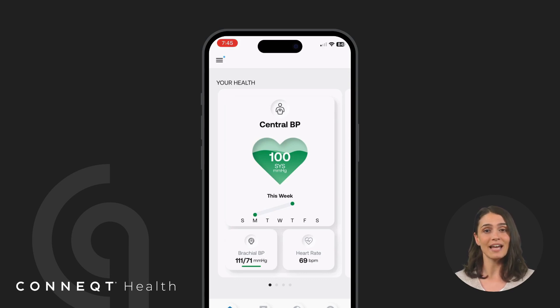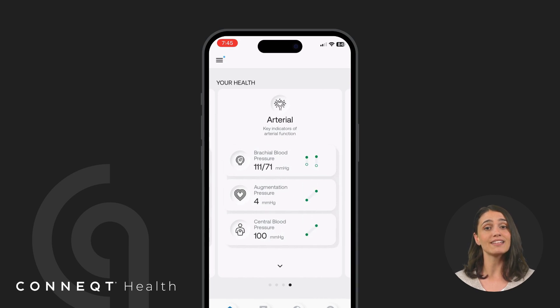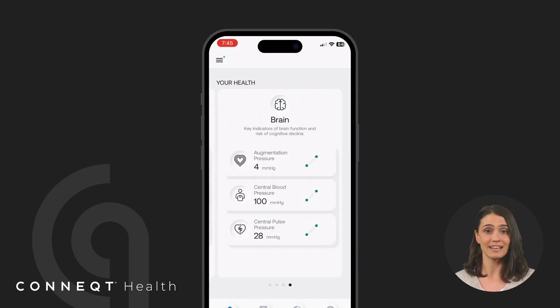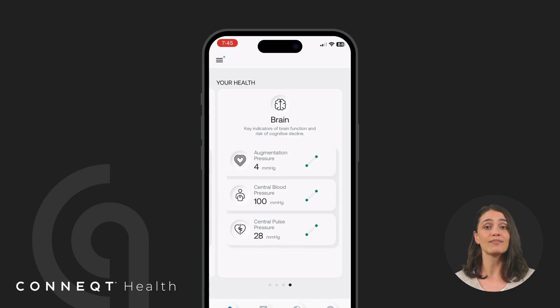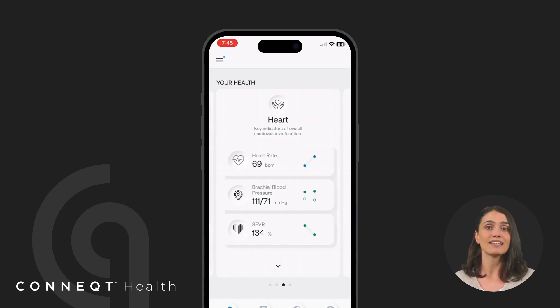When you open the Connect app, you'll see your data organized into health cards, such as heart, arterial, and brain. Each card focuses on a specific aspect of your health, providing an overview of key metrics relevant to that area.